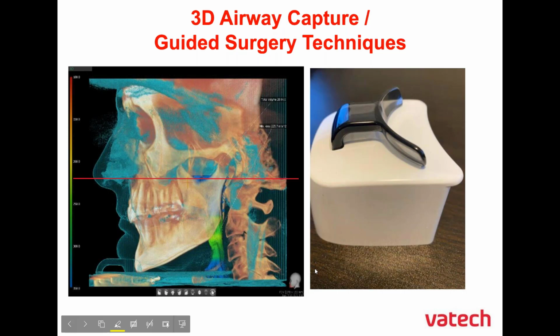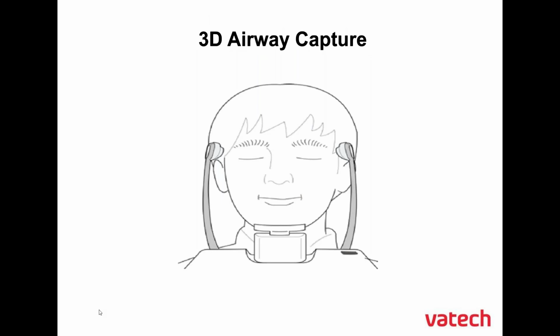on that. And to sum it all up, this next slide really shows them in the device, temple supports closed, chin on the chin rest, and then that edentulous cup right up against the labial aspect of the chin there.